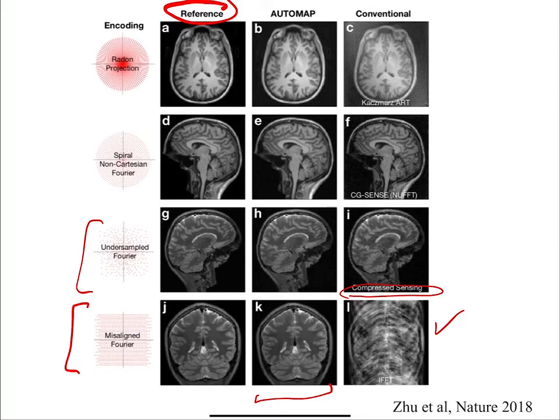And so the idea is that the images you see in the real world, anytime you're looking at biology, you're going to have certain themes that repeat over and over again. And so it's sufficient to look at lots of natural images and learn those features that are important. The idea is if I have an n by n image, right? So that means that I have n squared possibilities, right? Well, more than n squared. So there's n squared voxels. Each one, let's say, could take on a million different values. So I have n squared times a million different possibilities of images that I could have, right?